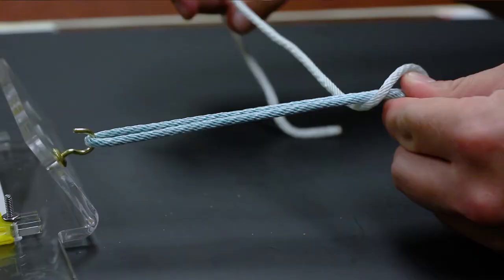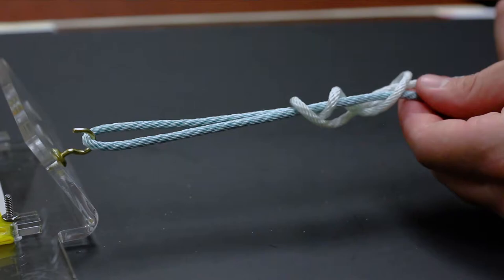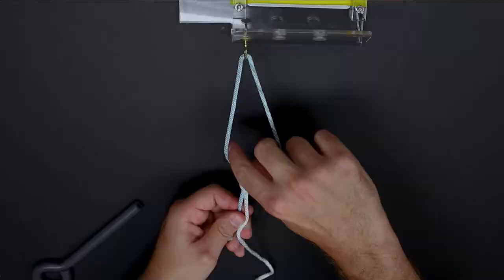This is tied by placing three throws over the top, over the top, and over the top. We then, after a third throw, bring it back through the initial loop we made and this has essentially created our knot.